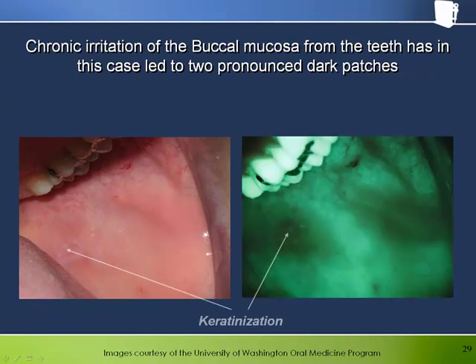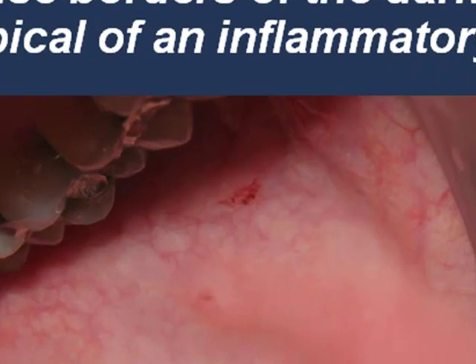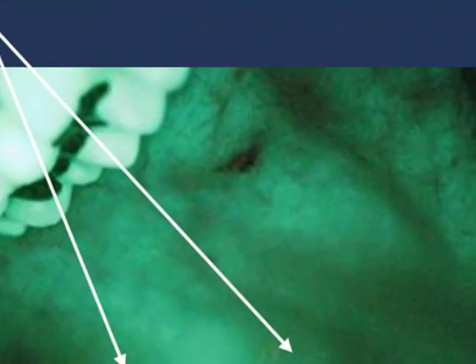Chronic irritation of the buccal mucosa from the teeth has in this case led to two pronounced dark patches rather than a line — still, the principle is the same. Notice the diffuse borders of the dark inflamed areas under Velscope. Also, vessel damage with extravasated blood associated with trauma has a corresponding very dark presentation under Velscope, which is entirely to be expected.